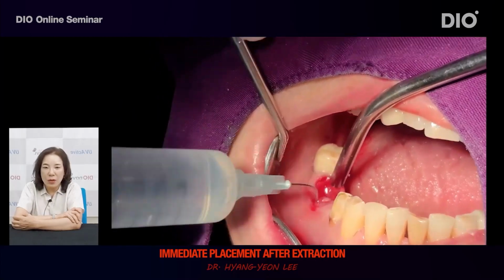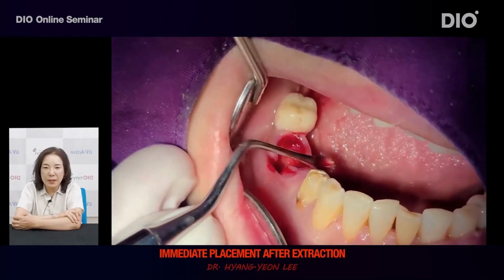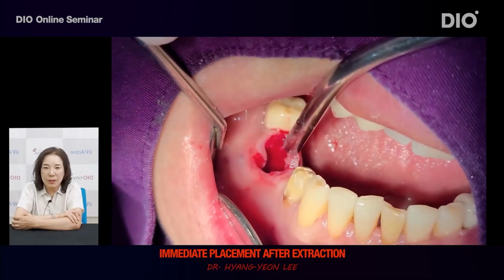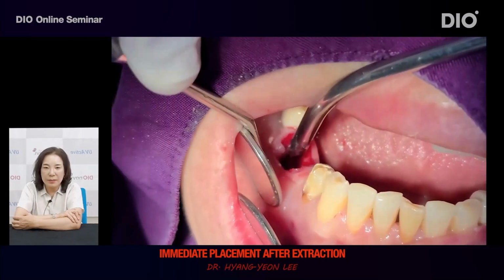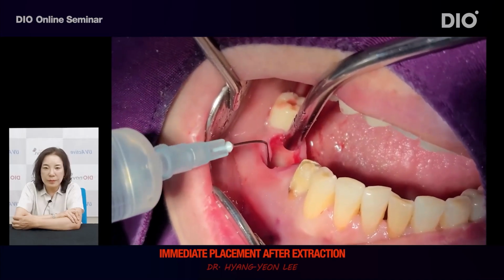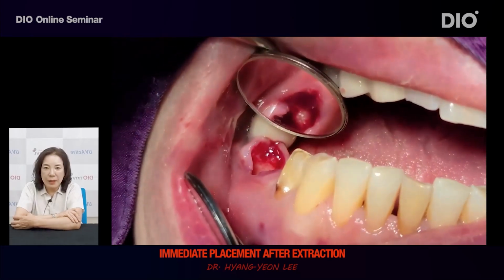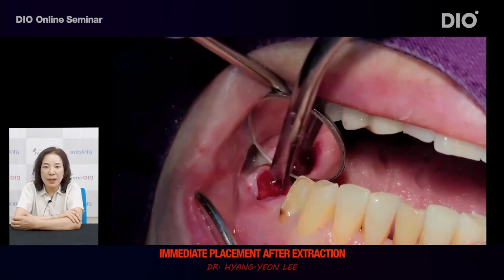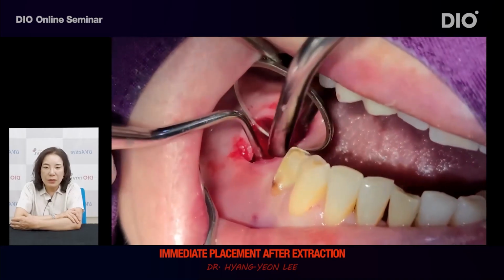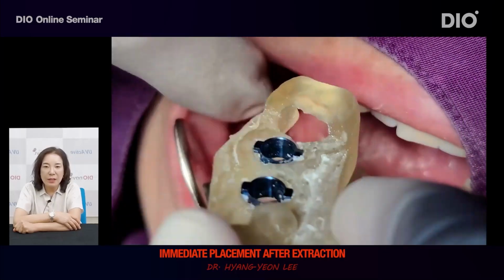Wash off with saline and check once again. Check whether it is clean, and remove the remaining inflammation tissues. Check whether there are remaining inflammation tissues, and perhaps the process of this curetting could take the longest time in the immediate placement after extraction case.